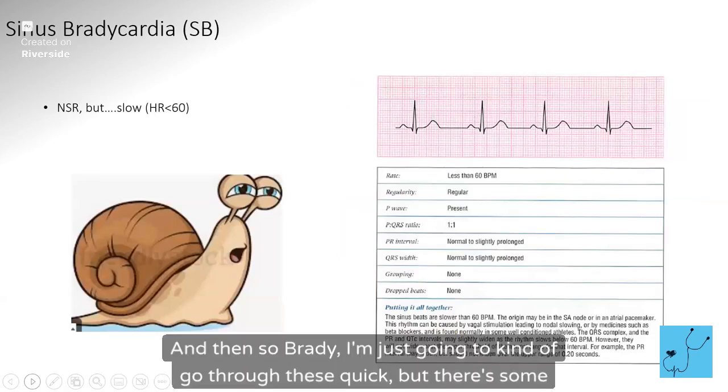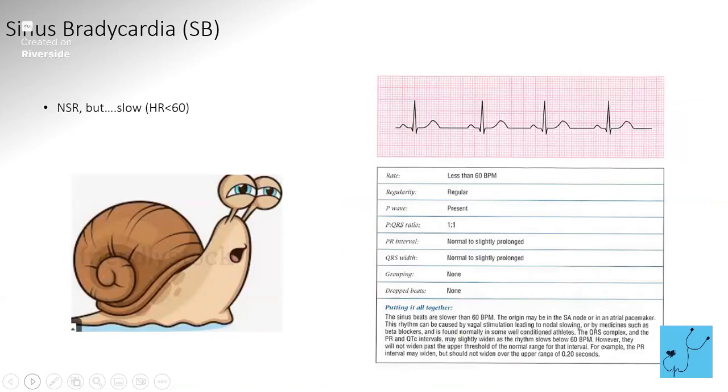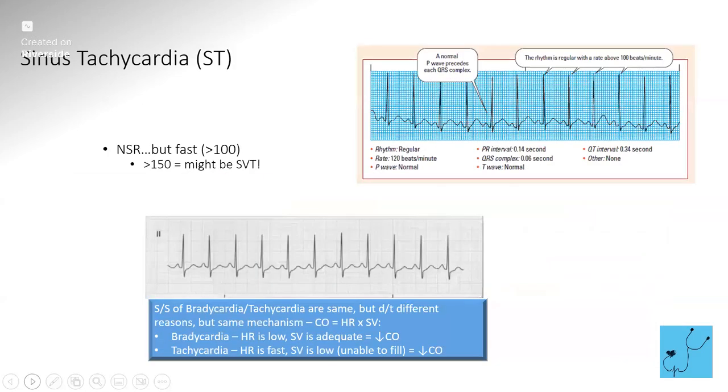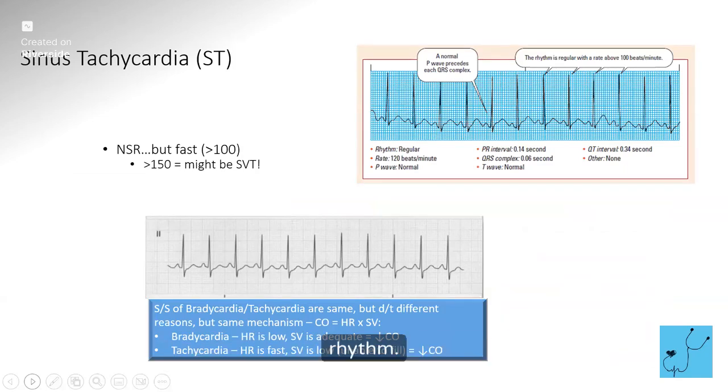And then Brady, I'm just going to go through these quick, but there's some notes for you there, all the characteristics of sinus Brady. We already talked about how to count it. And then sinus tach is also, it's just fast, but you have all the components of sinus rhythm.